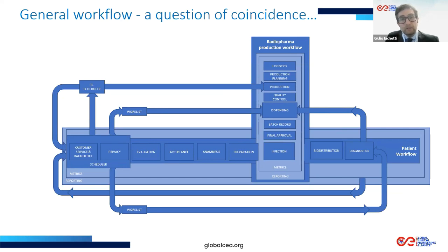This is very important because you always have a decay. So there is always a timing issue when you have to deal with a nuclear medicine exam.